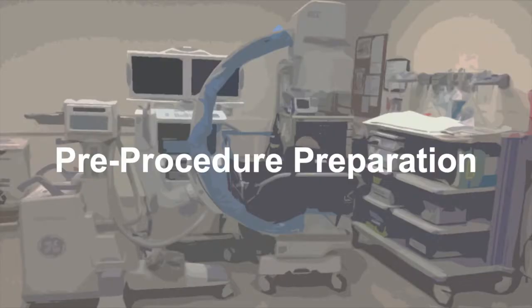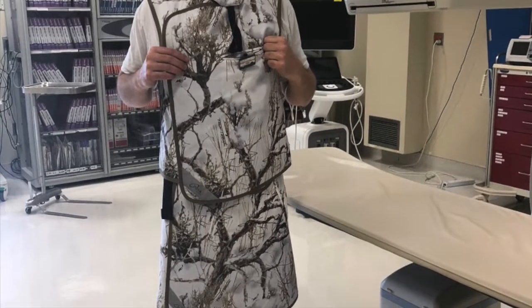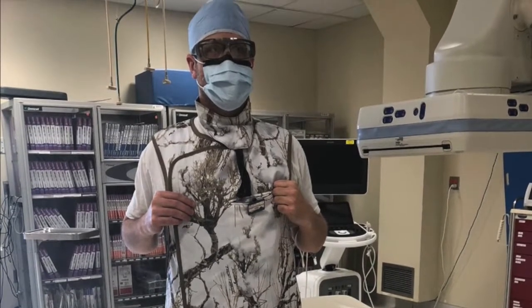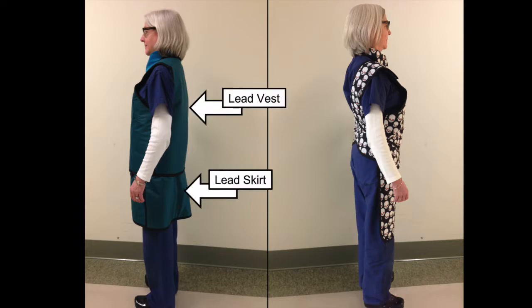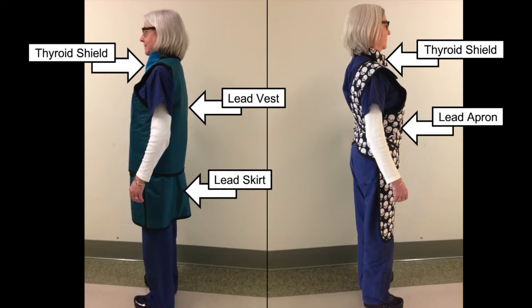Now that we are familiar with the C-arm, let's review important pre-procedure safety measures. Prior to starting the procedure, ensure that all staff is wearing protective equipment and a dosimeter. All personnel not behind a radiation shield or barrier need to wear a lead vest and skirt or a lead apron, and everyone should be wearing a thyroid shield.